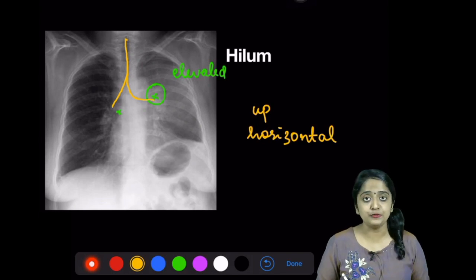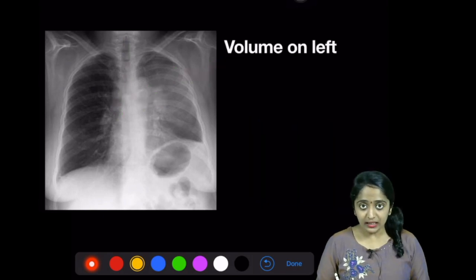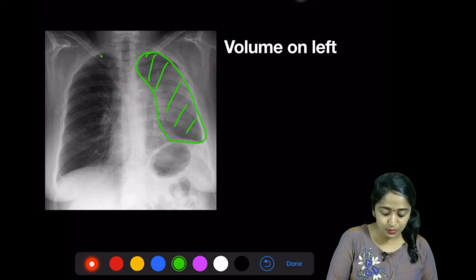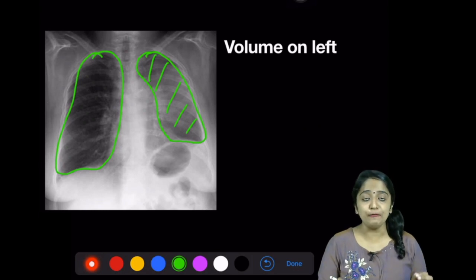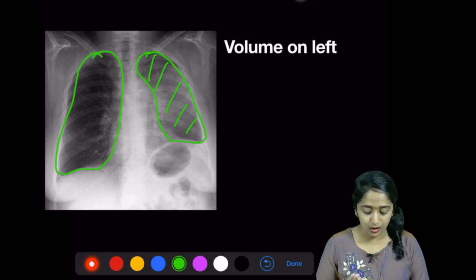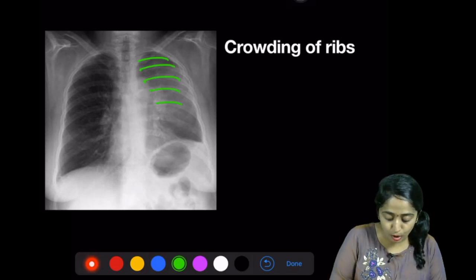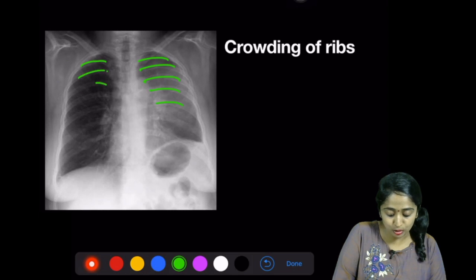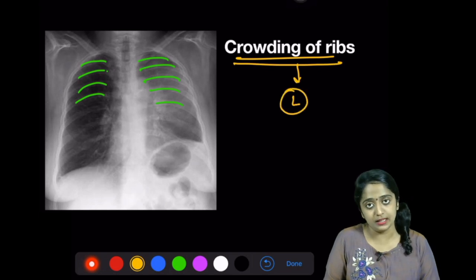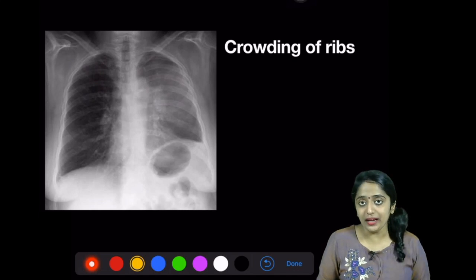The left bronchus is pushed up and it's more horizontal, so you have the hilum pulling up the left bronchus. What else is abnormal? Strikingly, the volume on the left side is much lower or reduced compared to the right side — so there is definite volume loss. Looking at the thoracic structure carefully, you can see that the ribs on the left side are more closely spaced than on the right side — in other words, you have crowding of the ribs on the left side.